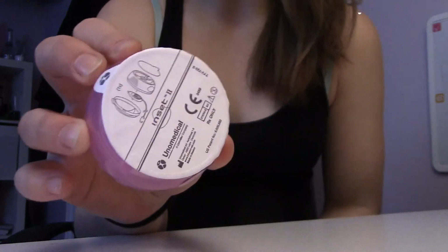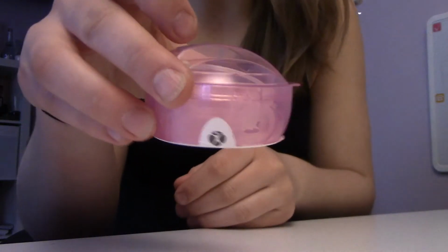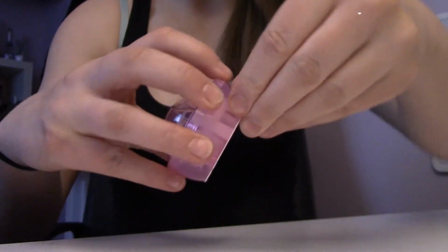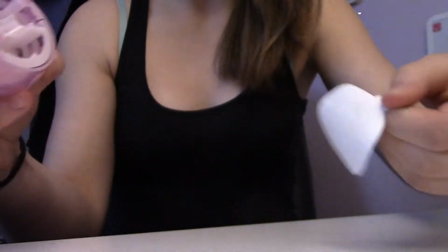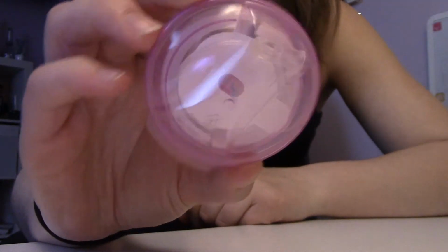Next thing I do is I take off this white piece on the bottom here. There's a little tab right on the side, if you can see. All you have to do is just pull it off. Super easy. Boom. And then you'll see the main part. So it should look like this.